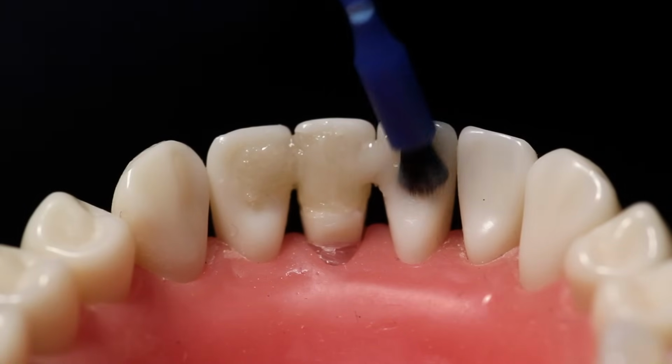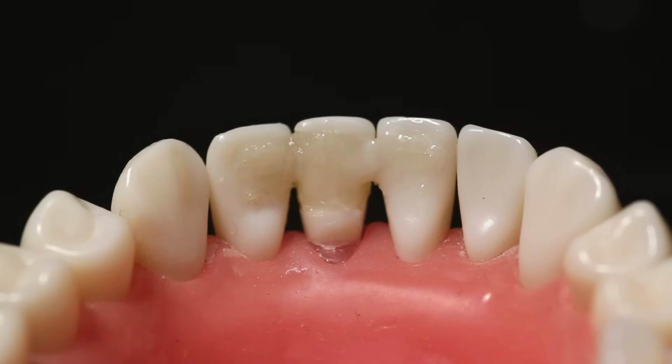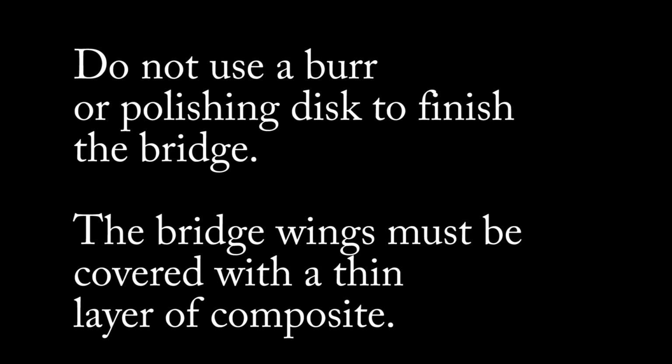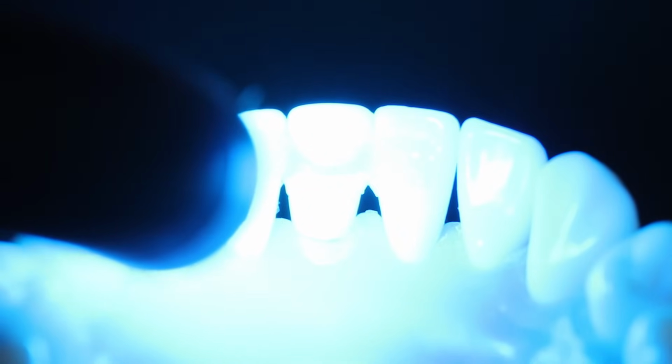and comfortable for the patient. Do not use the ribbon securing composite for the covering layer, as it is too tacky. Ribbon fibers do not polish well, but they need to be covered with resin. You want to avoid having to shape and polish the prosthesis using rotary instruments. When the covering layer is finished, thoroughly polymerize.